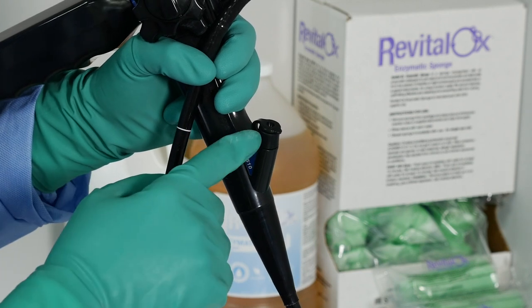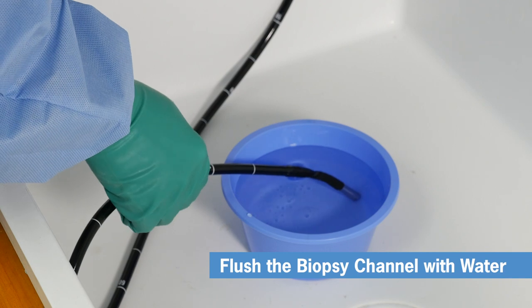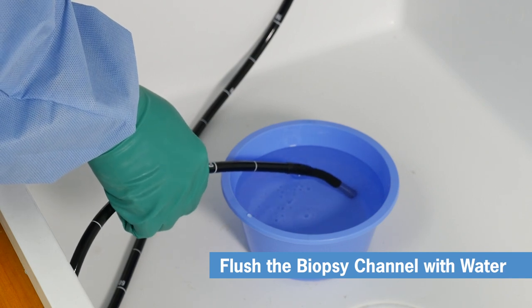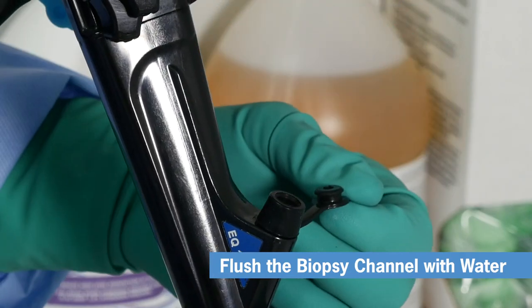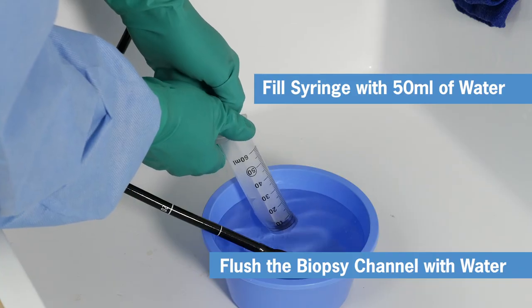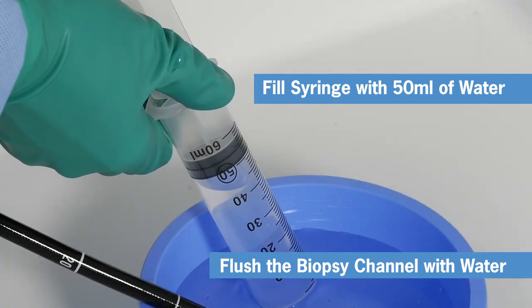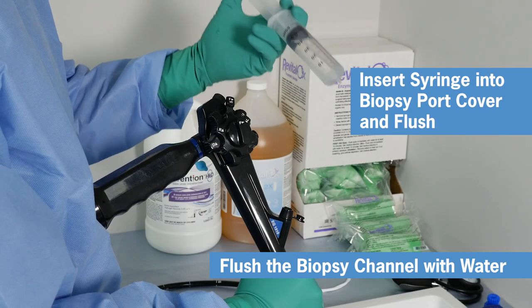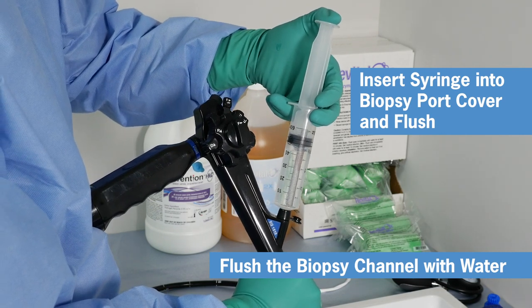Next, flush the biopsy channel with water. Place the Endo-i's distal tip into the basin and flip open the rubber cap over the biopsy port cover. Fill the syringe with water to the 50 milliliter mark, insert the syringe tip into the biopsy port cover, and flush. Repeat once.